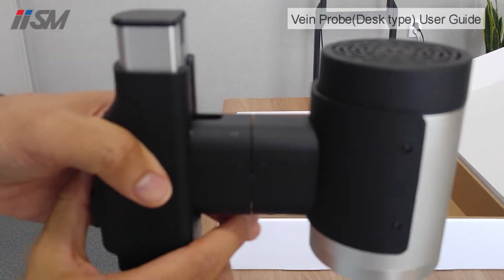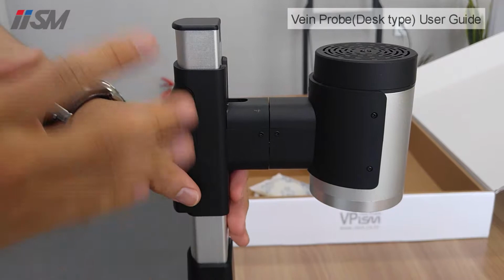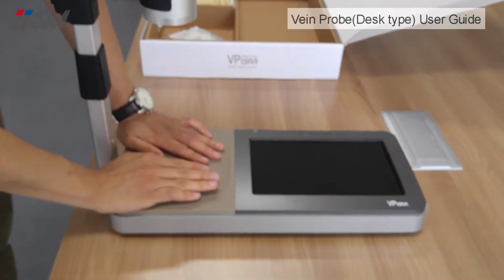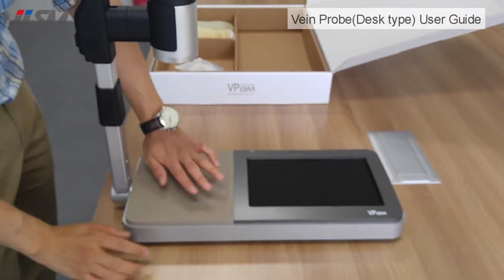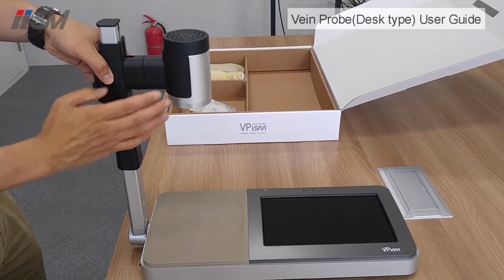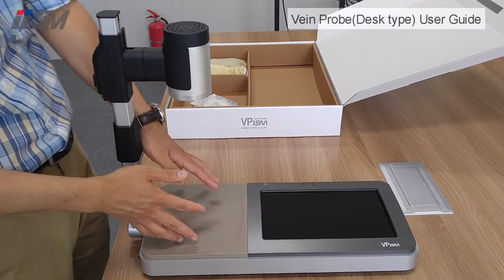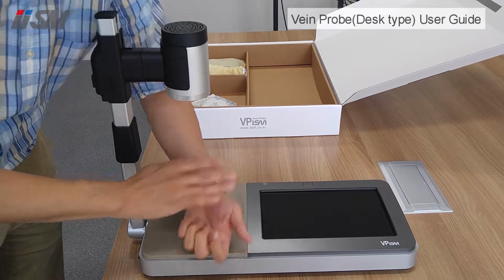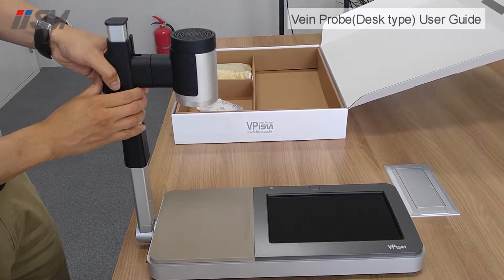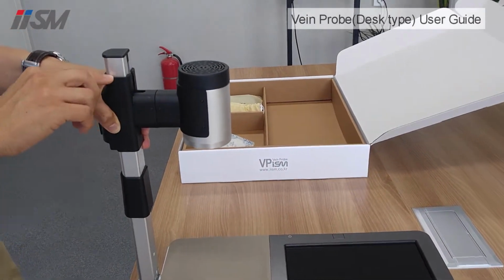Here in the beginning, you adjust it to number 3 for normal viewing. This can be adjusted according to the patient type. If the patient is very thin or like an infant, with a very small hand, then it will be closer to the bottom surface, so you can move the camera and the LED module a bit downwards. For people with thick arms and a higher position for viewing, you have to move the camera module upwards. However, most of the time number 3 will cover most of the patients.